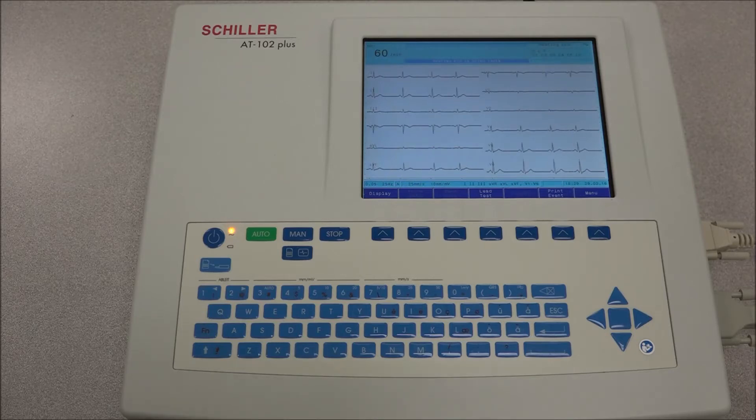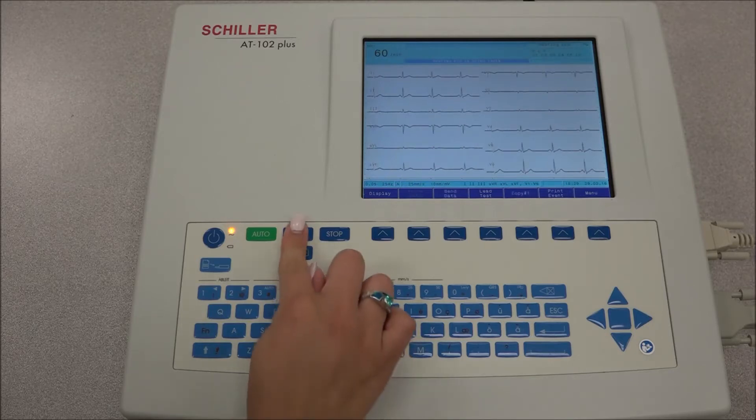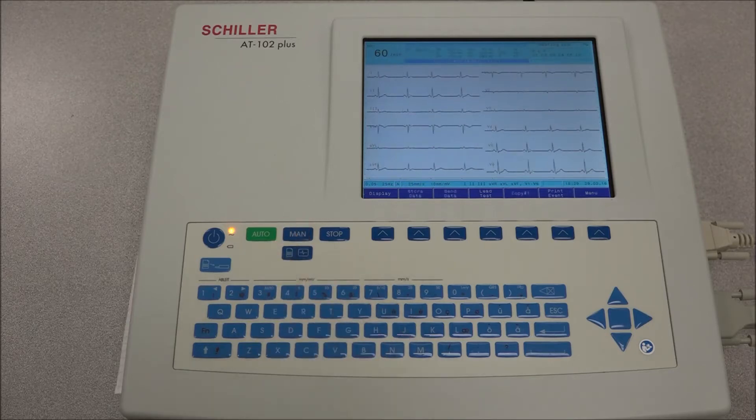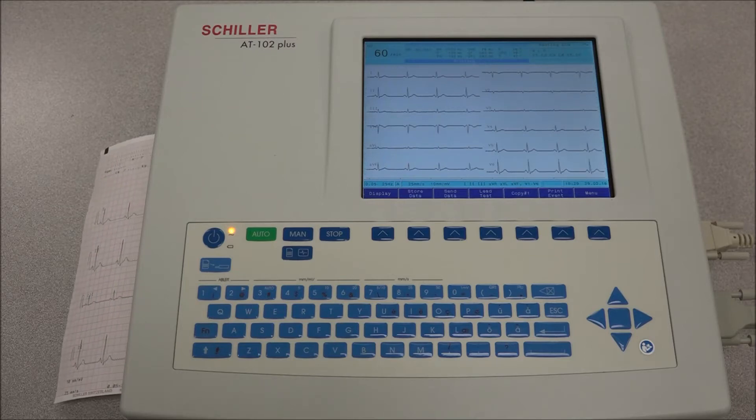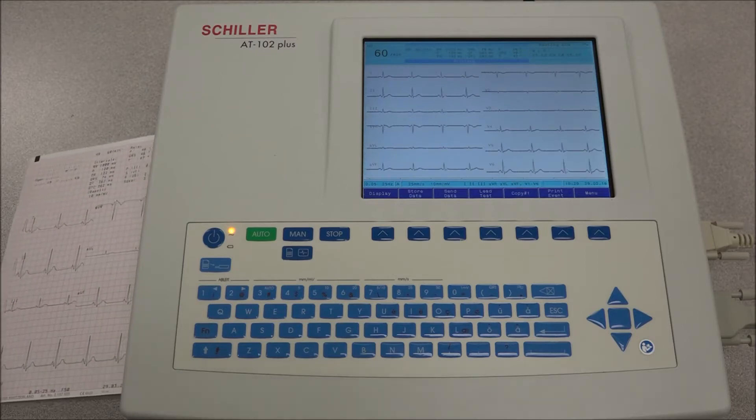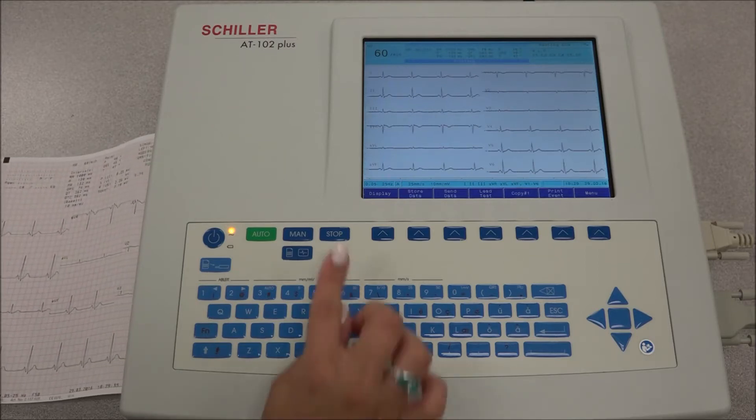For a manual recording, press the MANUAL START key and a continuous printout of the real-time ECG is given. Press the STOP key to stop the printout.